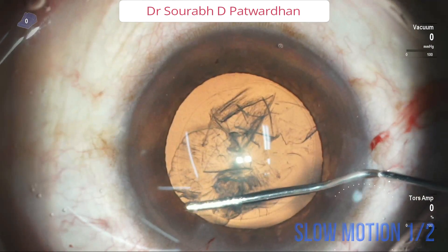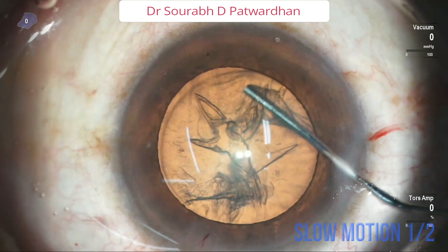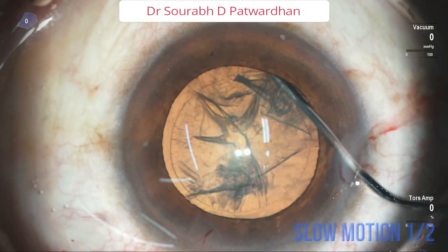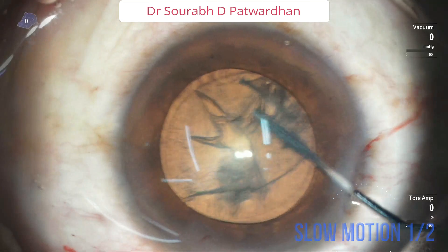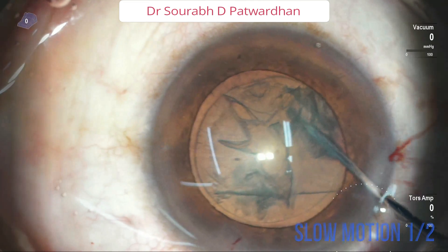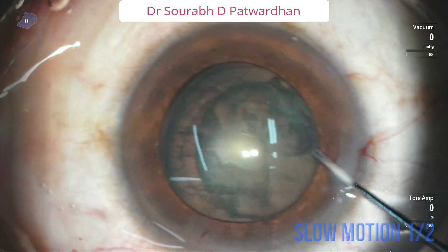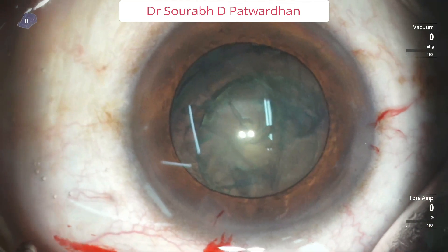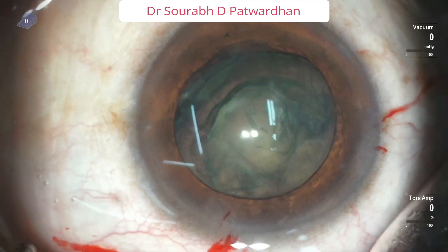See it again in slow motion. The first fluid wave, then I tap on the other side, then the second fluid wave. Then I go for hydro delineation by going into the substance of the nucleus and pushing more fluid. As it is a softer cataract, the nucleus will get separated, and now one of the poles is already prolapsed into the anterior chamber.